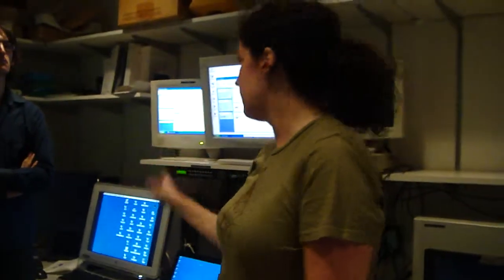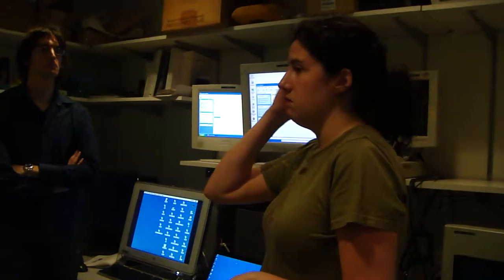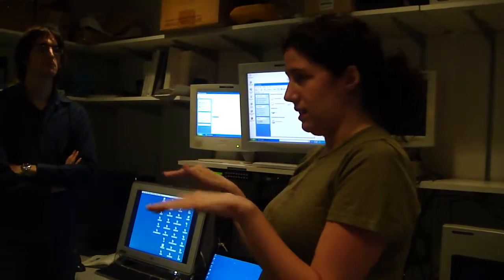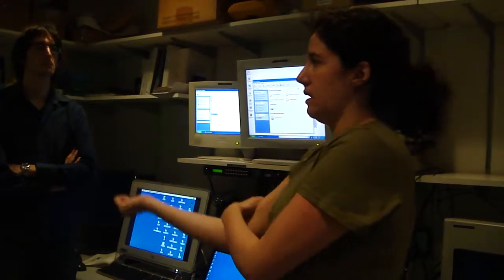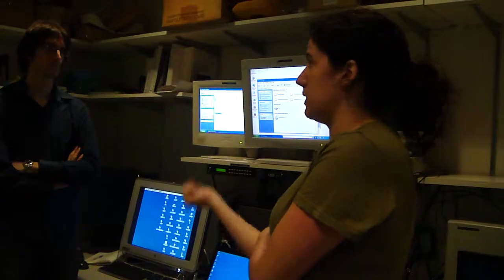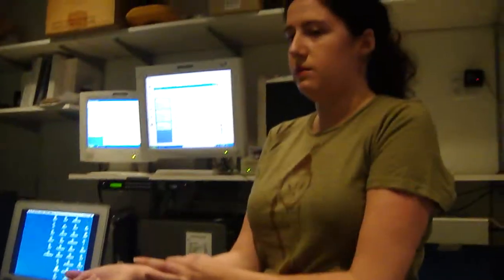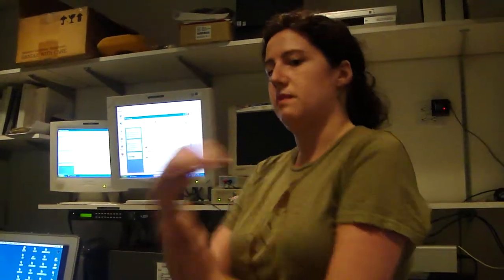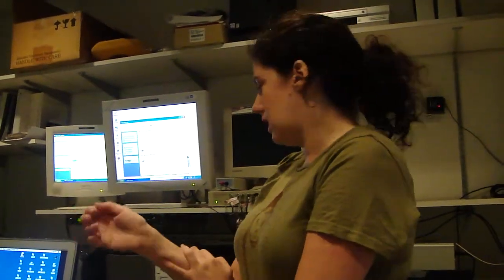Run prior, so like at the default window where you haven't yet chosen your test program, it is not maintaining a baseline for temperature for the subject. So you don't want to put it onto your subject until you've selected the test and actually entered test, at which point it starts to maintain baseline. You can always see it in the upper right. And otherwise the subject is going to get really cold at times if the system goes to resting. So just for your subject not to have it suddenly change, put it in there.